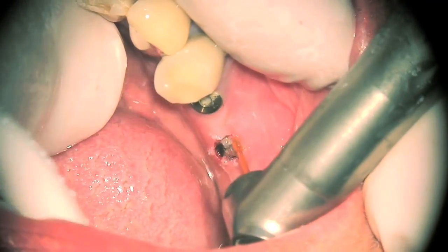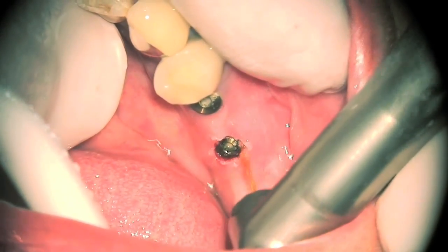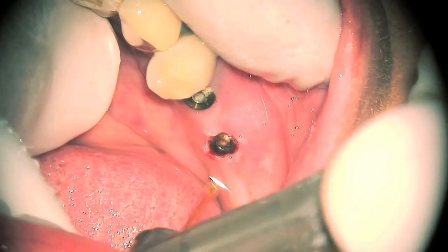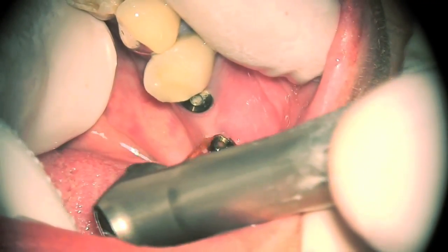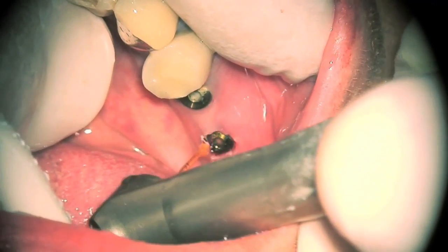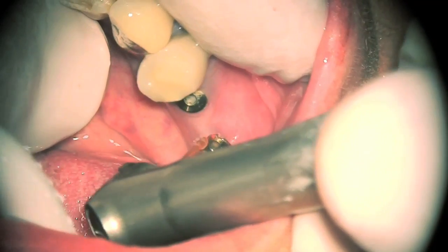Notice in this video how easy the laser dissolves away or dissects away the tissue. It does not harm the implant if you touch it with the tip, because this is a cold cutting laser. It does not heat up the implant whatsoever.